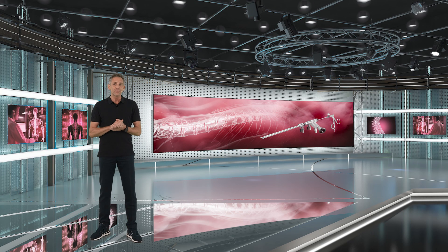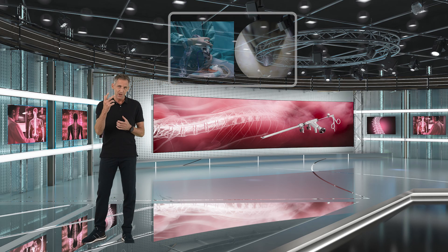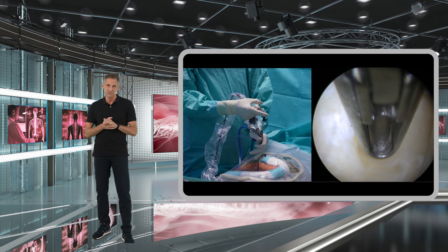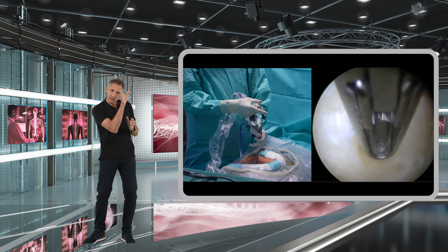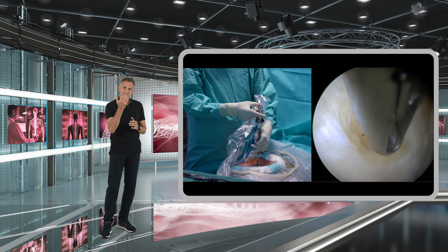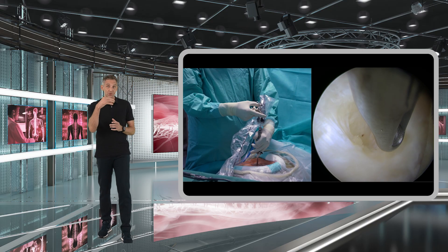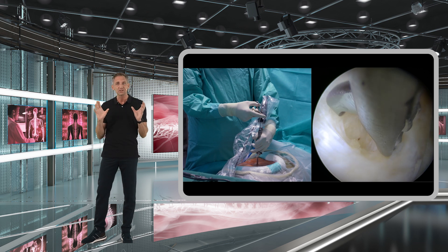Whilst going through the yellow ligament, it is important that you see the tip of your sharp instruments at all times. One frequent beginner's mistake is that you stand behind your instruments — you can only see the back of the instruments but you can't see what you are doing with the tip, and that's not safe.